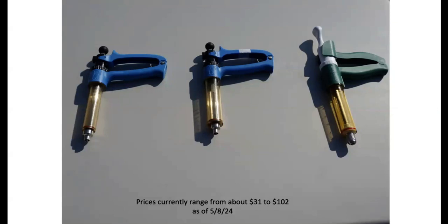If I'm using a 5 cc vaccine, I'm going to use a 50 cc barrel. The other thing that comes in handy there is if we're using a 25 cc syringe and we're doing 2 cc's, then it'll hold just over 12 doses. The 50 cc barrel, if we're doing 5 cc's, would hold 10 doses. So we're looking at 10 to 12 doses if we match those up to the volume of product we're given there. That works out really well when we think about changing needles.